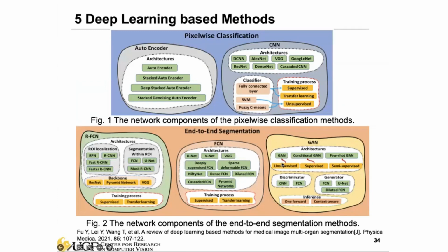So those are the classic segmentation methods. But now, since deep learning has taken over all the different tasks and domains, advanced deep neural networks can perform much better compared to those classic approaches. For those classic approaches, we can consider them handcrafted or hand-engineered. We use some design principles and prior knowledge to build the algorithm to produce the segmentation map.